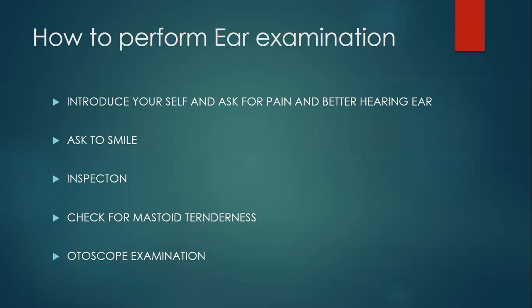When you're doing otoscopic examination, you need to observe the external auditory canal and the peripheral areas, and then go right into the tympanic membrane and comment on the tympanic membrane also.